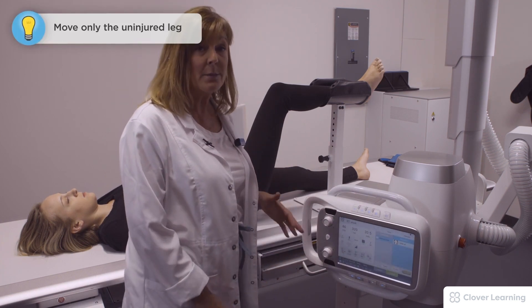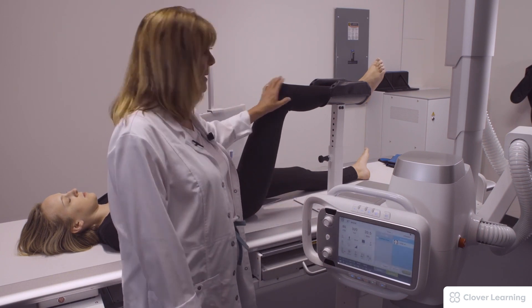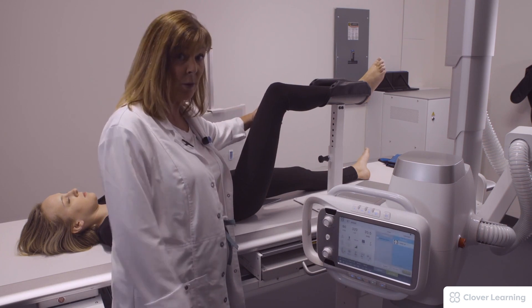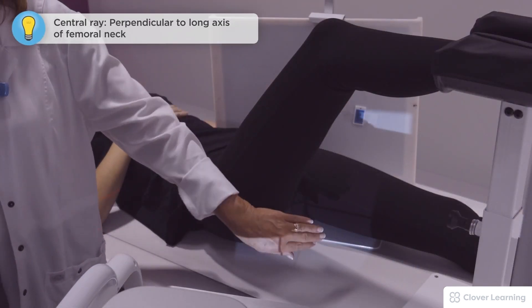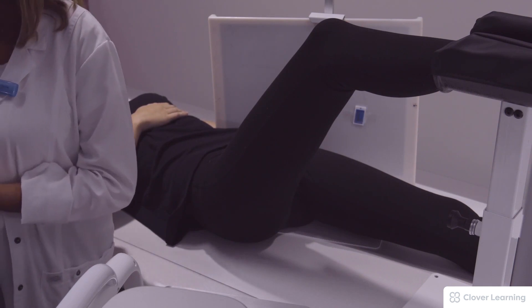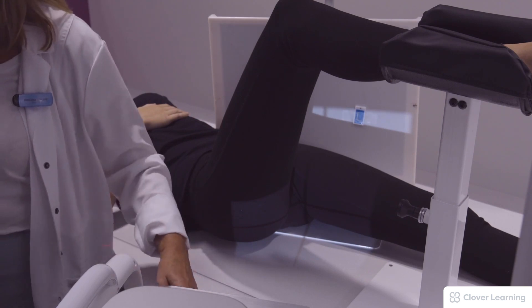Because the left leg is injured, we never want to move an injured leg, so we move the uninjured leg. We've propped it up, and the more we can flex the leg the better — we want to get the leg up as much as possible. The central ray is directed between the legs, perpendicular to the long axis of the femoral neck, with a 40-inch SID.